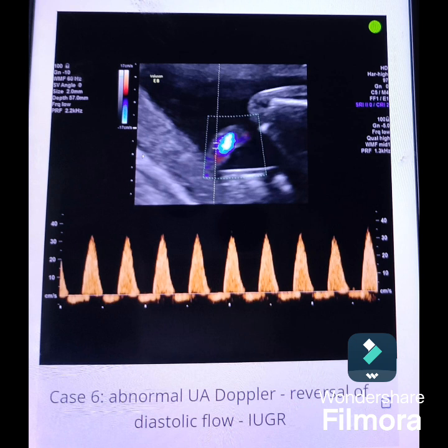So if ductus venosus Doppler is done at 13 or 14 weeks and it shows an inverted, reverse A wave, then cardiac anomalies in the fetus are diagnosed. Now in the later third trimester, if the baby has IUGR and the ductus venosus shows inversion of the A wave, then imminent delivery has to be done, even before 30 weeks. So these are the two uses of ductus venosus.